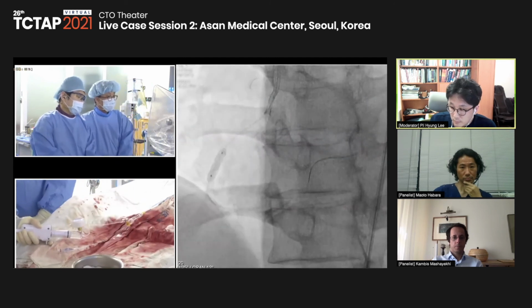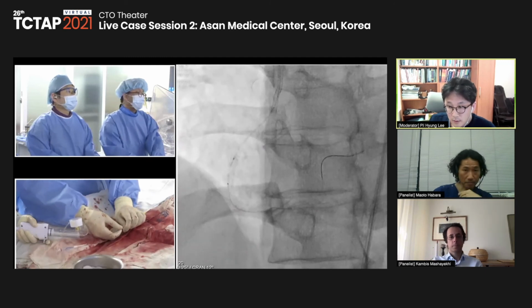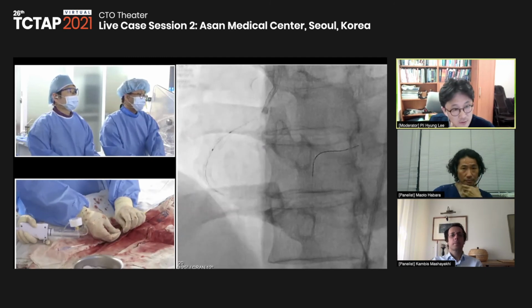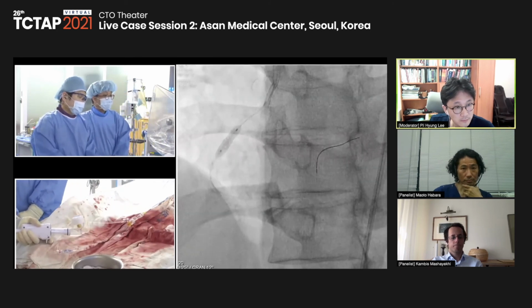Excuse me. Okay, patient. So do you do a routine follow-up angio in selected patients? And if yes, what kind of patient do you follow up for the angio?